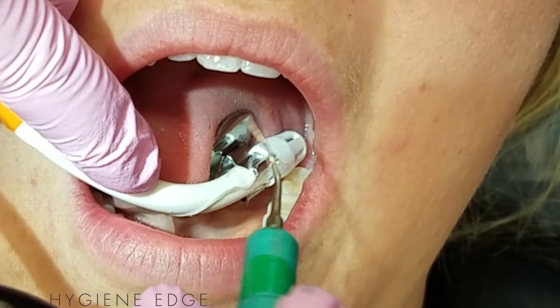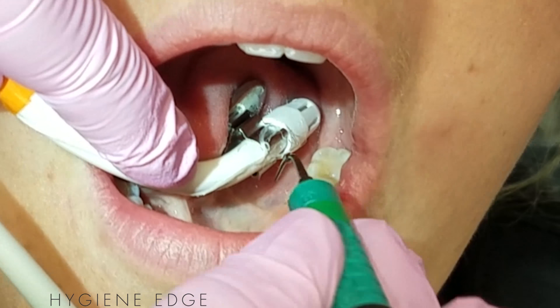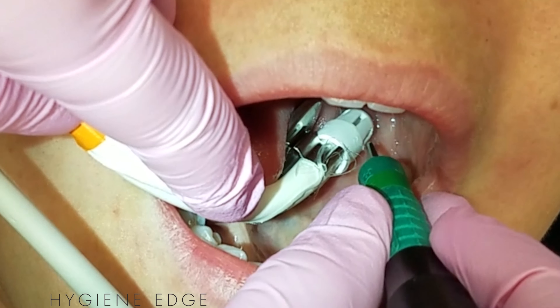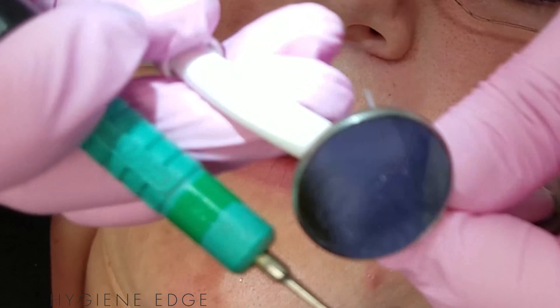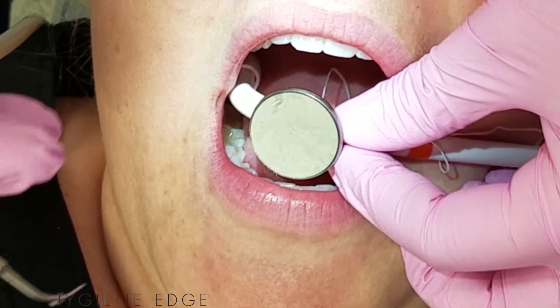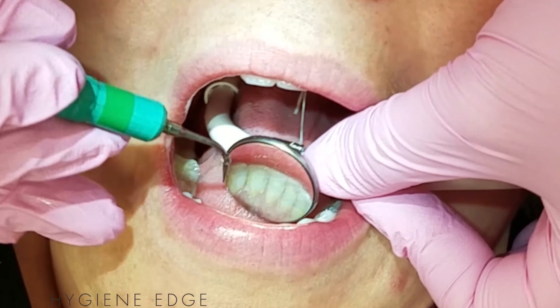You can bend the suction as needed for indirect vision and retraction. If you can see directly, you can turn the mirror clip to aid in retraction like so. Or if you have an area where you just want to use your regular mirror, you can bend it over the lip and use it for suctioning and trade off during the procedure.